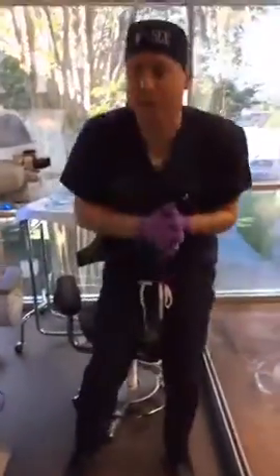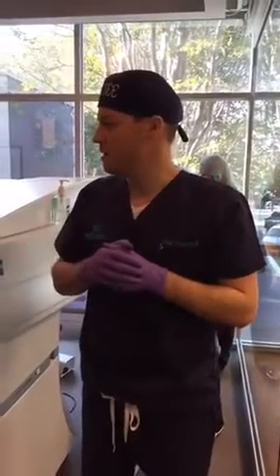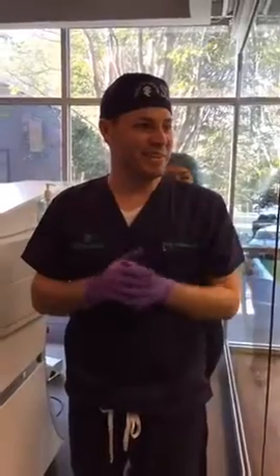She did awesome. This is a laser that prepares the eye for the vision treatment. And you can see it just takes a few seconds. She's not having any kind of discomfort at all. We use medicine so that you don't feel anything. And now they're just getting her ready, and we'll do the second laser, which also just takes a matter of a few seconds. So it looks like she's doing good, huh?